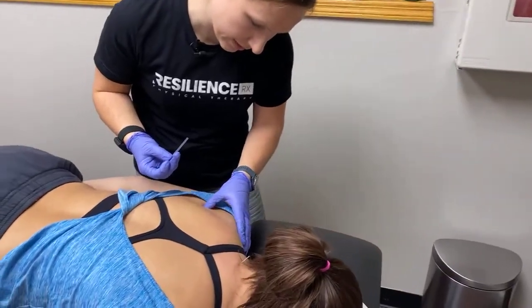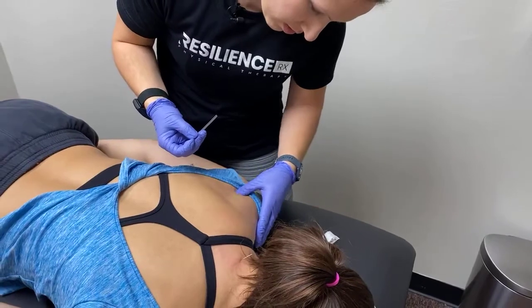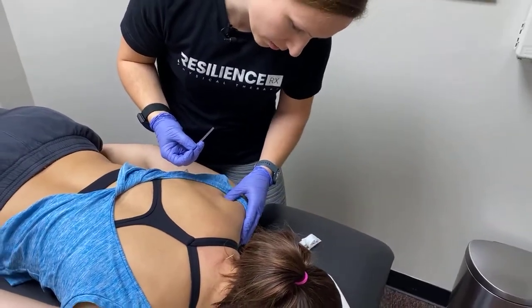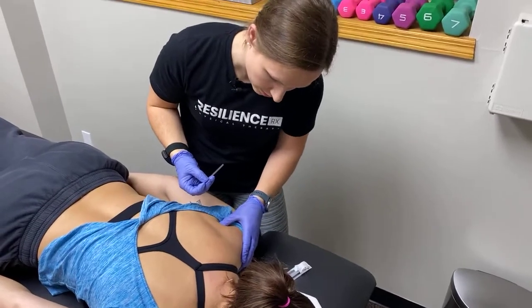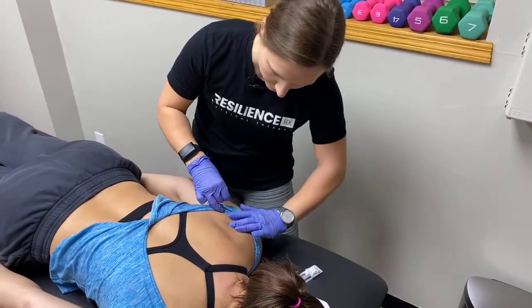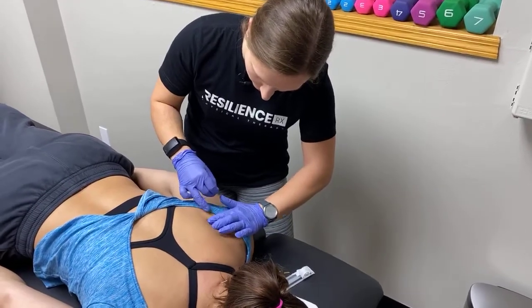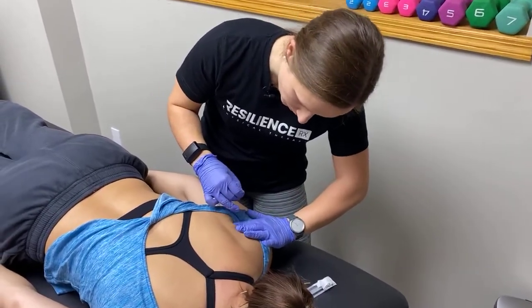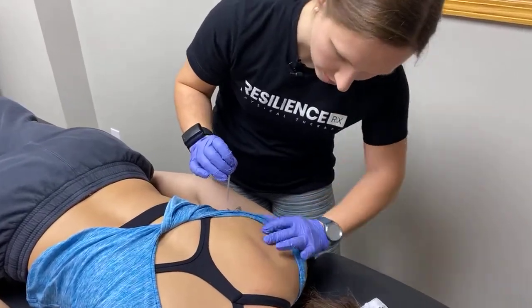So kind of right there is where you get most of the tenderness? Mm-hmm. Okay. Any out here too, or not as much? Not as much. Okay. What about right there too? Okay, so right in here and then right in here. So we'll go for both of those areas.